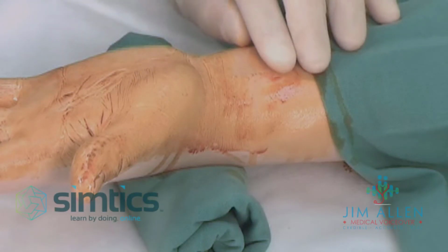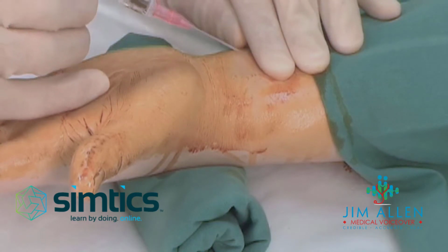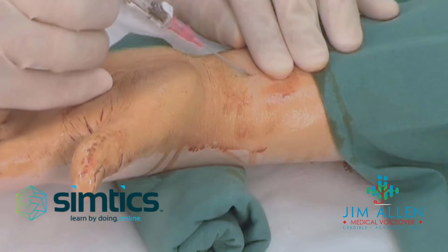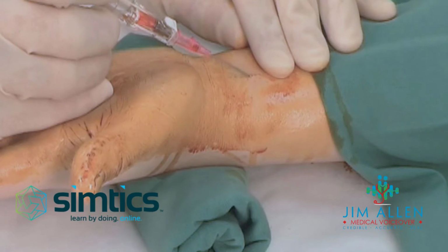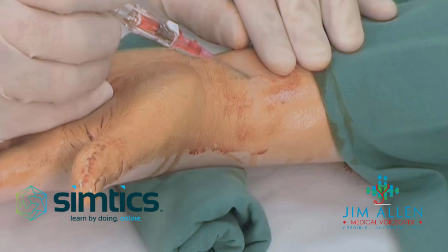Palpate for the radial pulse with your non-dominant hand. With the bevel of the needle turned upwards, insert the needle at an angle of 30 to 40 degrees to just under the skin surface. Continue gentle insertion until there is a flashback of blood into the hub of the needle.